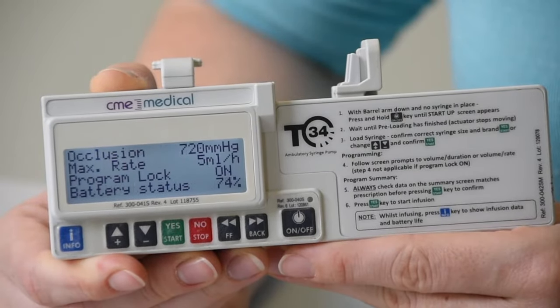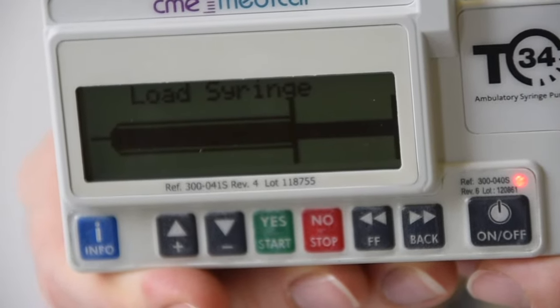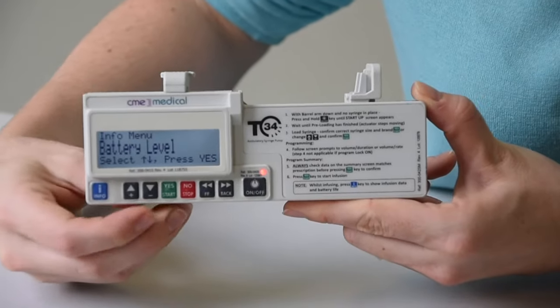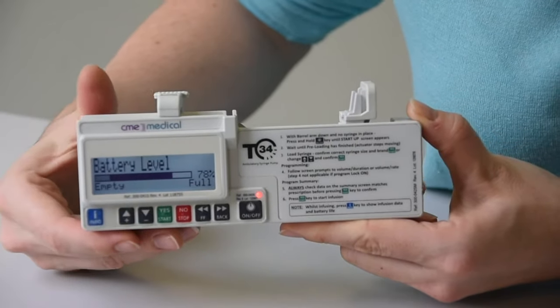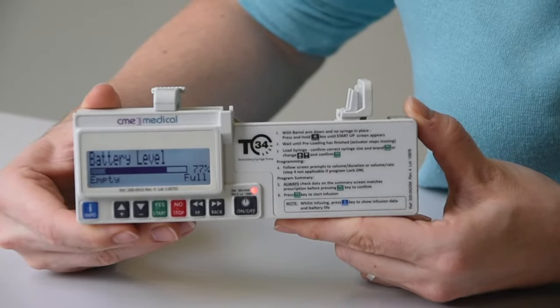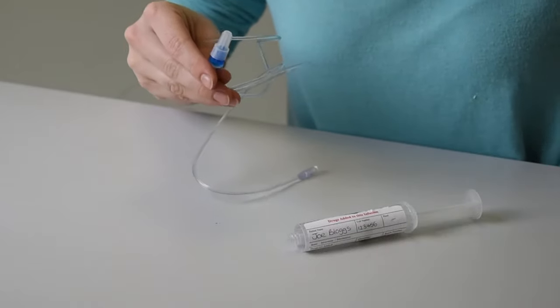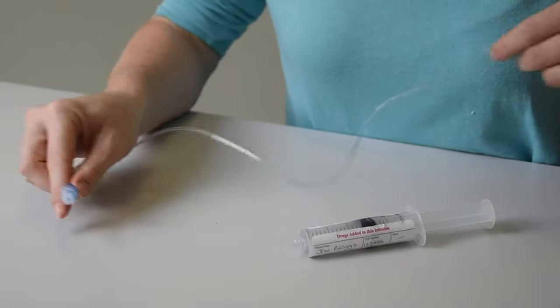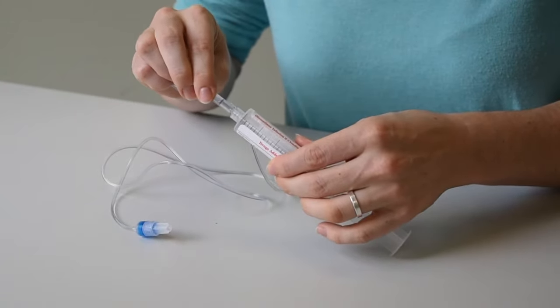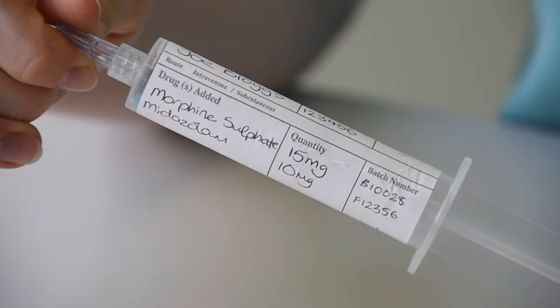Preloading. Once the screen says load syringe, check the battery level by pressing info and then yes. Ensure there is enough for 24 hours, which is 35% and above. Next stage is to prime the line if it is a new syringe or new prescription. You must ensure you are using a CME line. Once you have labelled your syringe and primed the line, you are ready to set up the syringe pump.